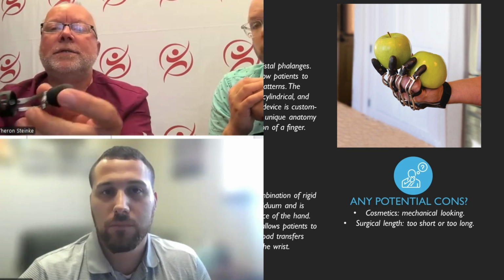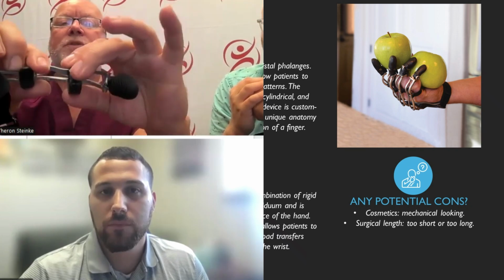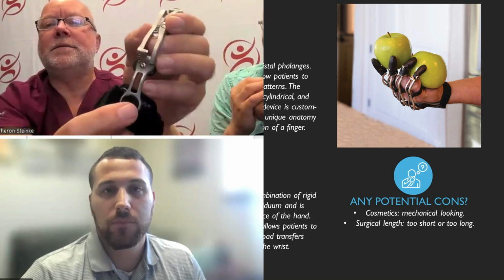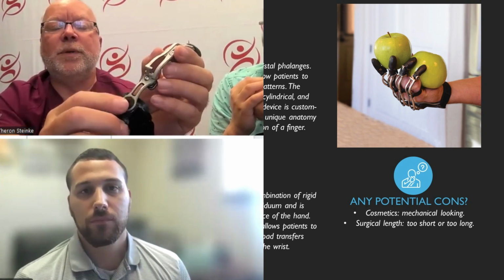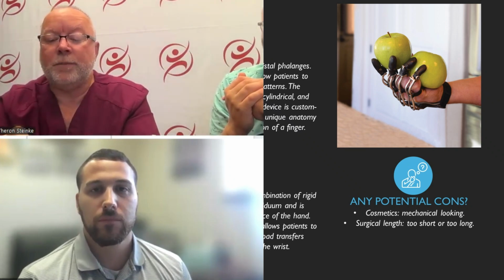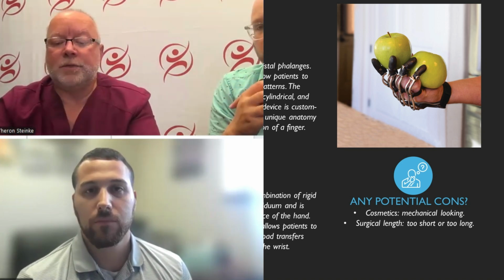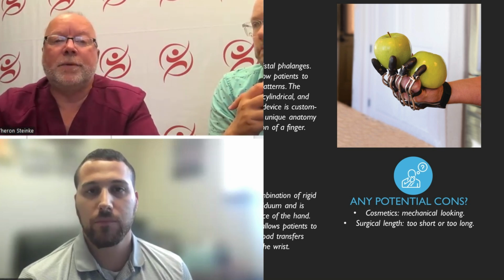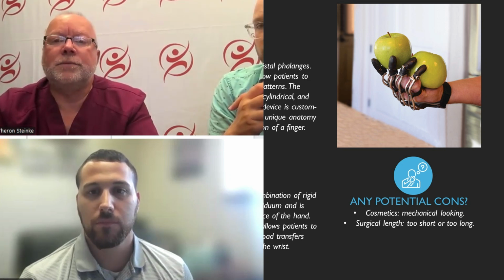So the adjustments are the same thing here. You can see where you put the rubber shims in those two holes, and then this piece here can be adjusted back and forth right here. We would get that set, and then this gets adjusted too. So if that does take place where they're getting more range of motion, we can adjust. But that patient just got quite a bit more range of motion, and it made it so he had to have a new one, which was fine. The insurance still covered that. That's actually a really good thing. He did go to therapy and use it there for, I think, two months maybe, and then being on the job actually helped too.